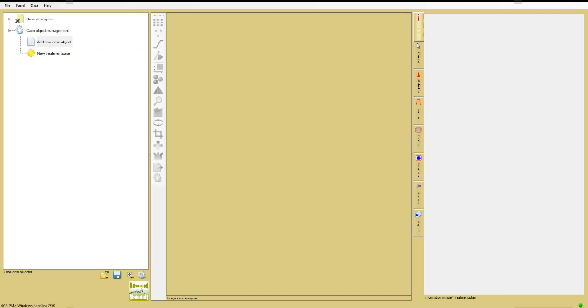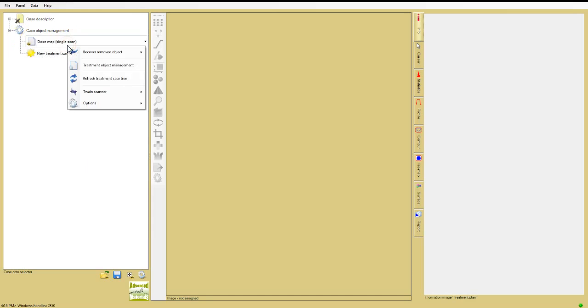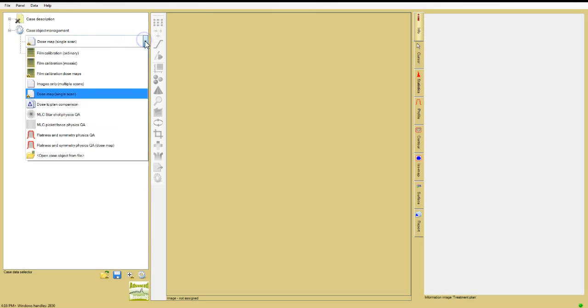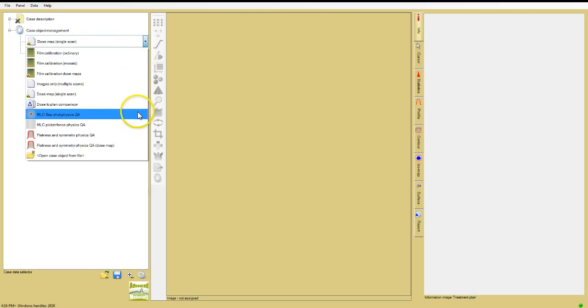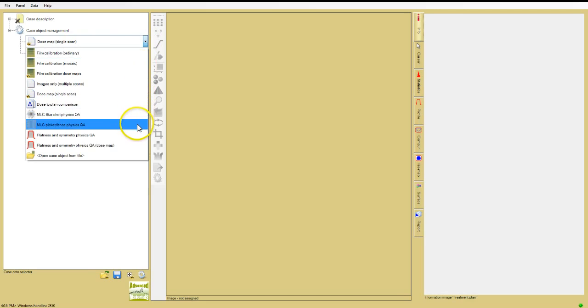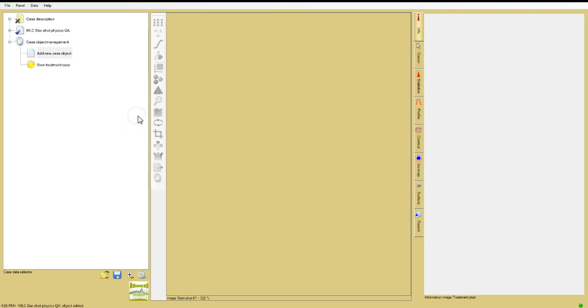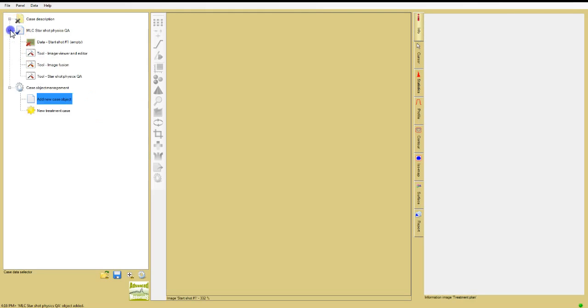Open the FilmQA Pro application, and in the case management object at the bottom of the case tree in the case data selector window, click Add New Case Object. Expand the pull-out menu and select MLC Starshot Physics QA, then click the plus sign to expand the starshot object.